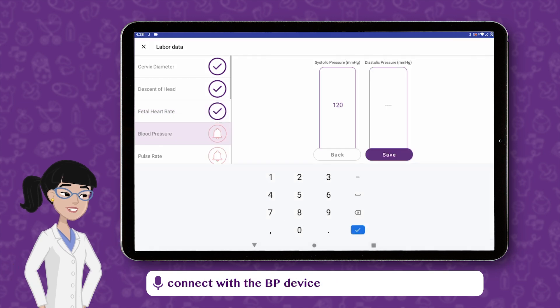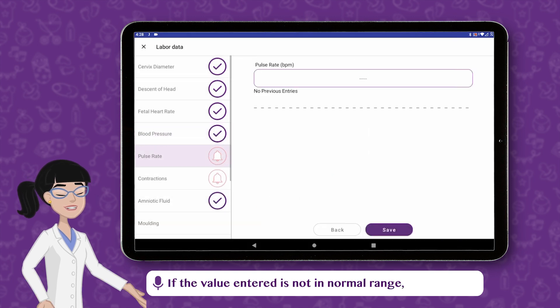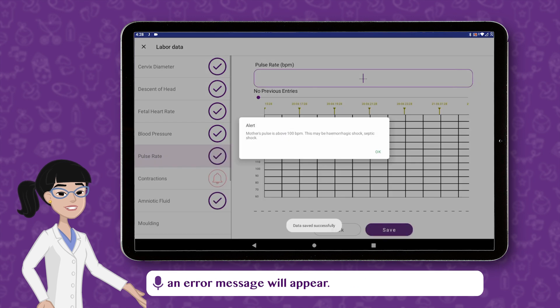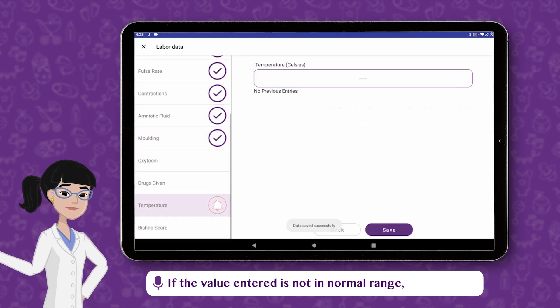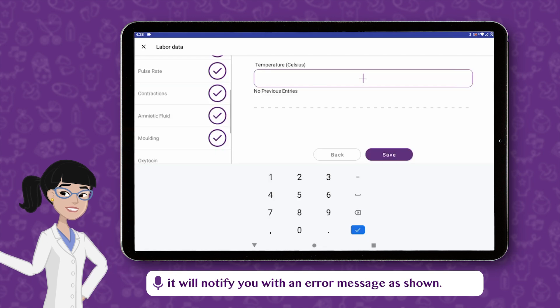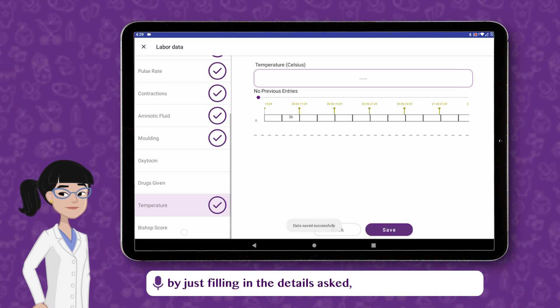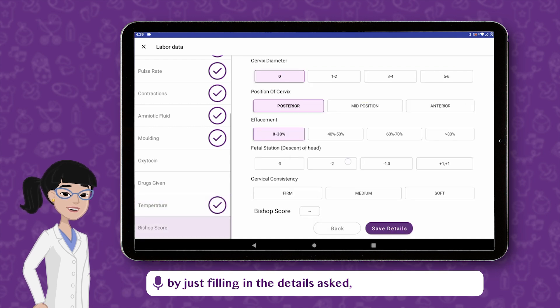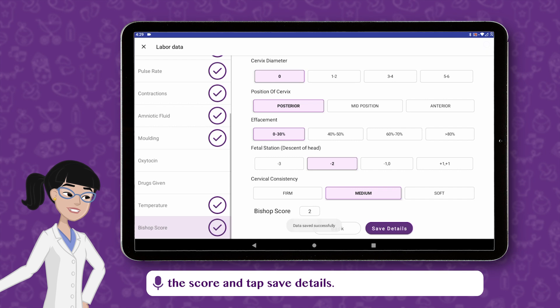For blood pressure, either connect with the BP device or enter the values manually and tap Save. If the value entered is not in normal range, an error message will appear. Enter Temperature and save it. If the value entered is not in normal range, it will notify you with an error message. You can calculate Bishop's score with ease by just filling in the details asked and it will automatically calculate the score. Tap Save Details.